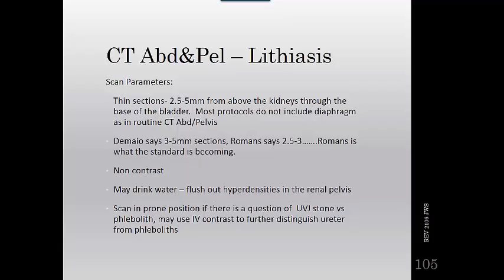But if there is a question and it still is not working, you can use IV contrast, and that'll distinguish the ureter from the phleboliths. Sometimes when you scan, there'll be tons of phleboliths down there, and you can't tell what's a stone or what's not.